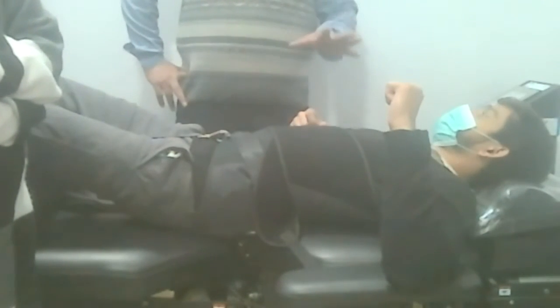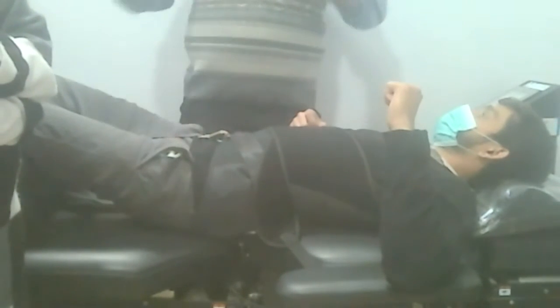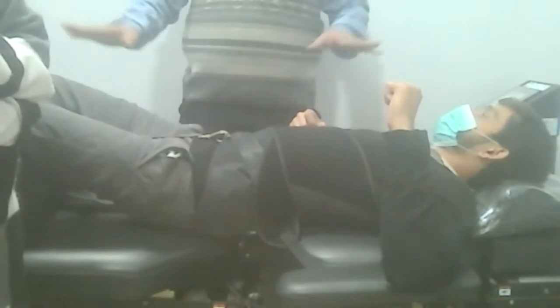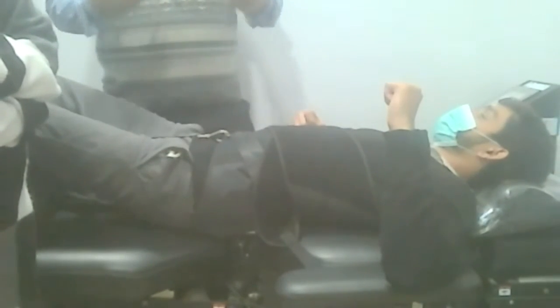Just consider one thing, that there are so many variables that make it an art to learn. There are a number of variables, just like many keys on a piano or keyboard. You need to produce what kind of music you want to get to. It needs your skills, your understanding, your basic knowledge, in-depth knowledge of the entire procedure.